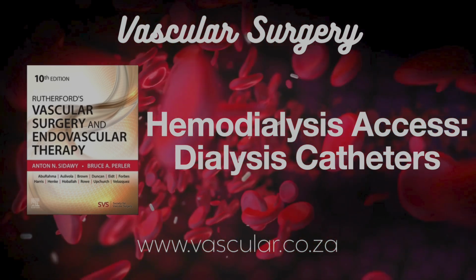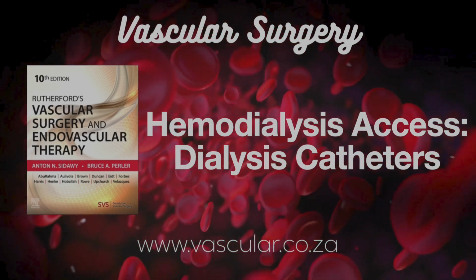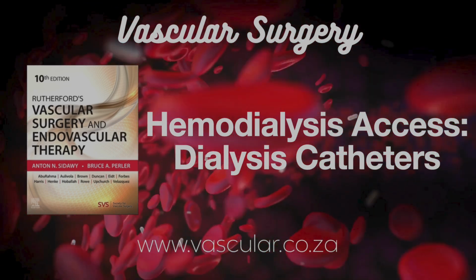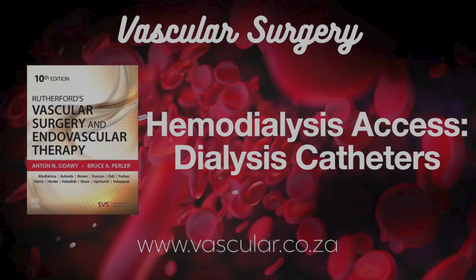Bedside placement, really strongly discouraged. You need sterility, the imaging, and potentially the ability to intervene immediately if something goes wrong. Got it. Fluoroscopy is non-negotiable. Yeah. What about anesthesia and prepping the patient?